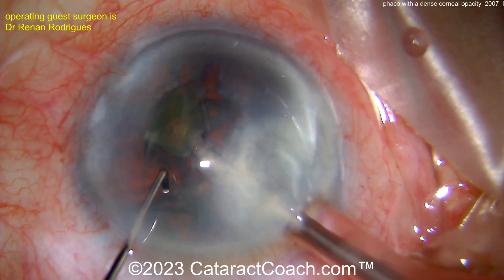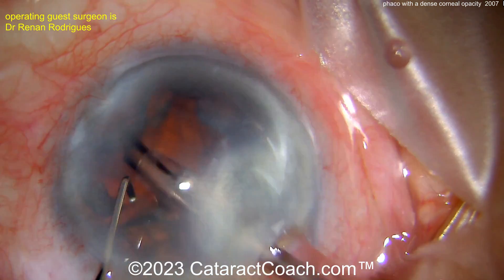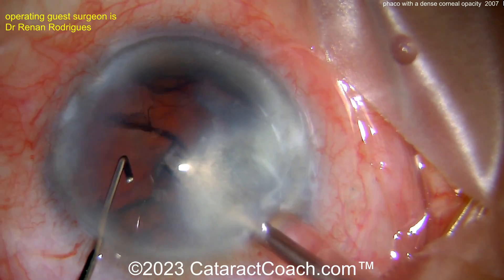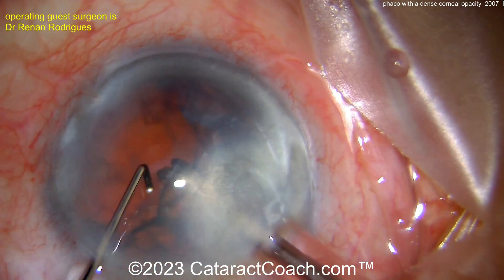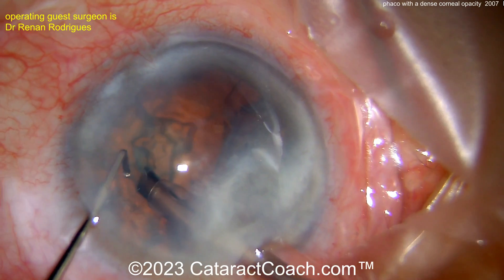That corneal incision may not seal up so well, because remember, it's not a normal cornea — you have a scar there. There may be some endothelial loss. With our main phaco incision in most routine cases, we're relying on that corneal endothelial pump function to initially help seal up that incision, and that may not be so strong here. So putting a suture in at the end of the case is probably a good idea.